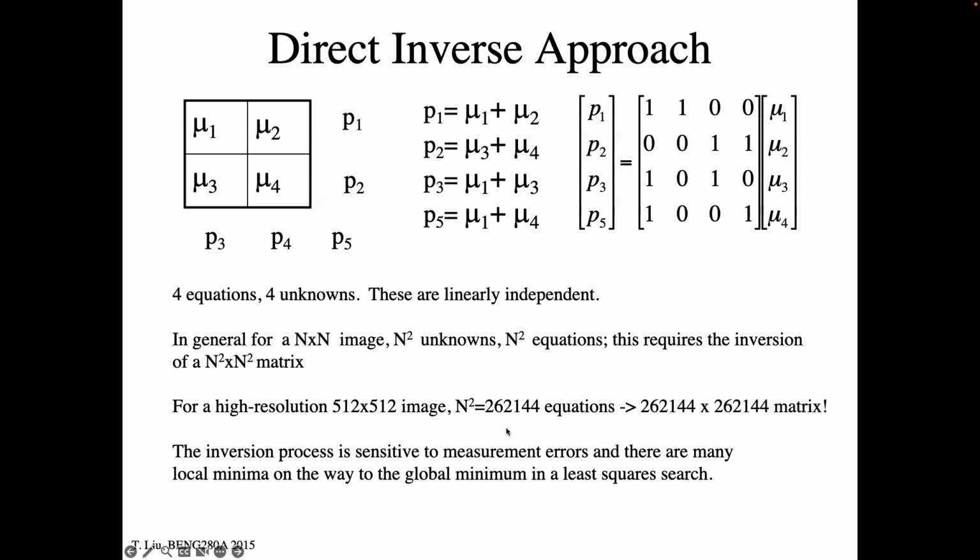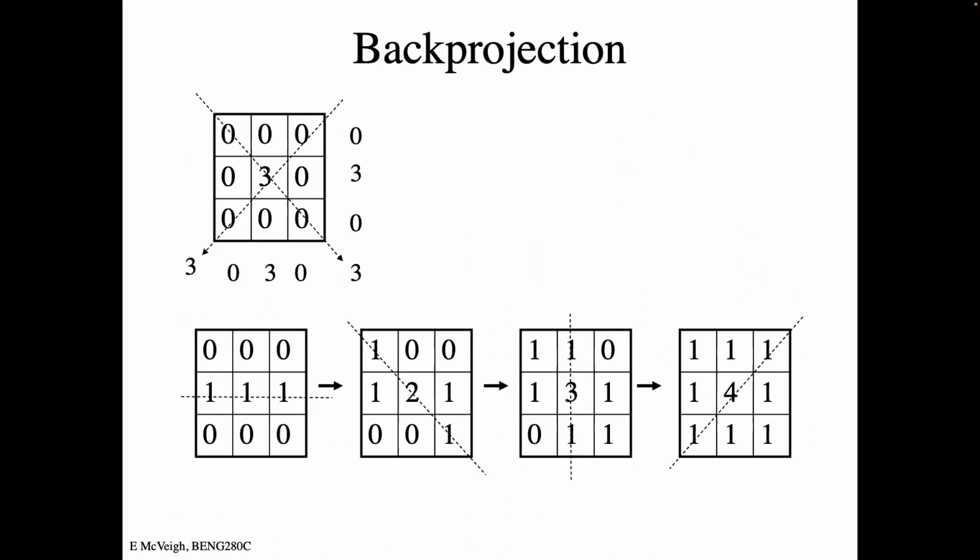So that has not been done. Well, I shouldn't say that. It has been done in some instances with very large computational resources. But a trivial way to do this, and we saw this in SPECT, was, well, let's take our data and just back project it.